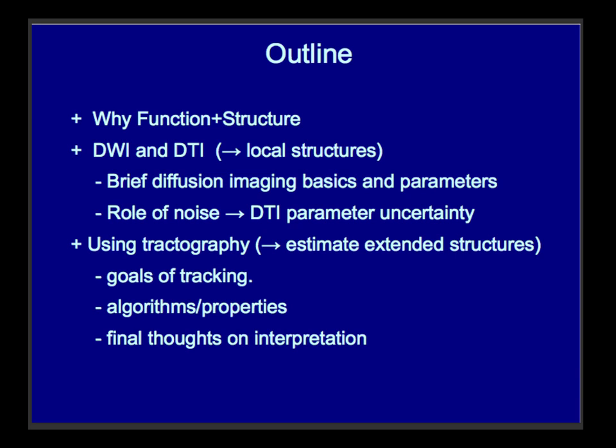Even if you take a histological brain and you freeze it, how do you find out where the structures go? You have to slice it up and then reconnect those little broken bits across these frozen slices that have changed shape even by drying and freezing and all this. So it's a really hard process, and you couldn't do that for living subjects. So we try to do something as best we can computationally.